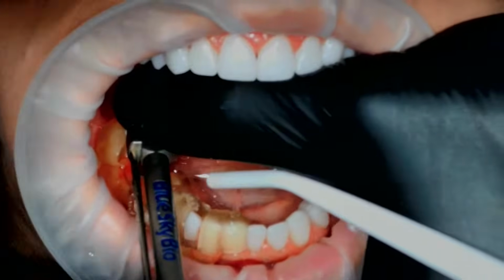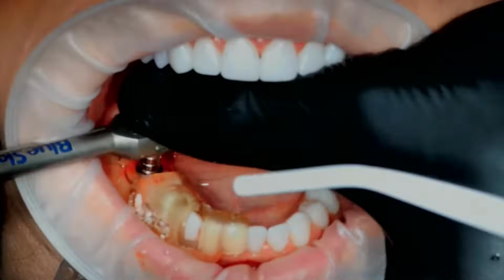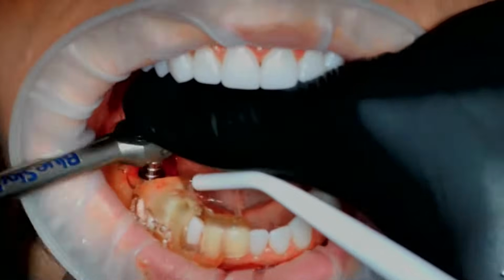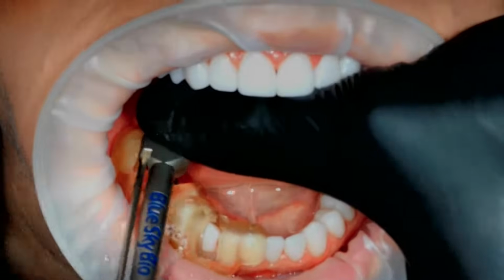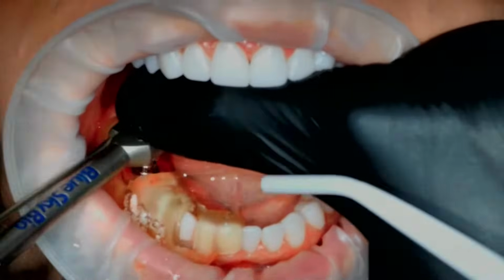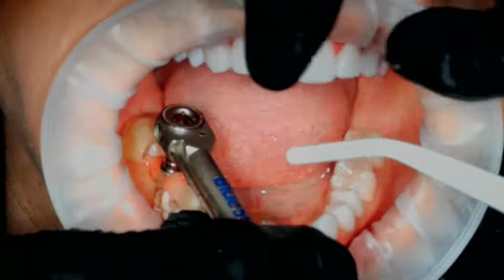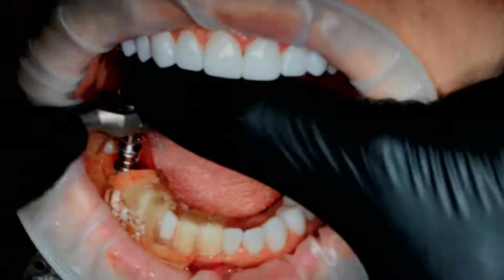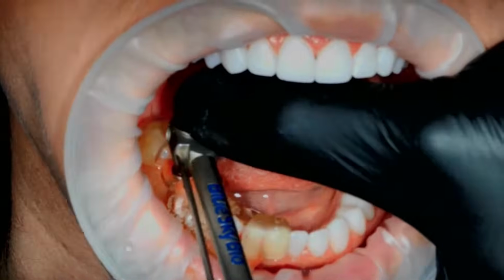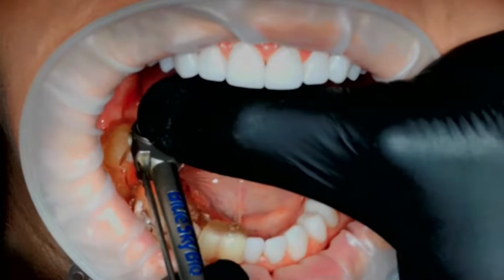This is a bigger issue when we're doing a front tooth, right? If you get a front tooth knocked out and we're placing an implant there, we really need to have some strong torque to make sure that implant won't move while we have a crown on it, hopefully for you, so you can smile and not have to be missing that front tooth. Guided implants are phenomenal for cosmetic implants. This obviously we would not consider a cosmetic implant, although every implant I try to make look nice and cosmetic. But there I am getting a final torque, just finishing it up, and there we are.